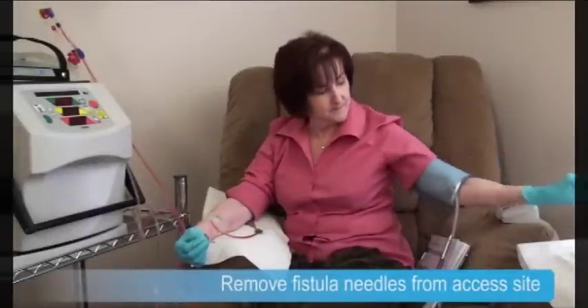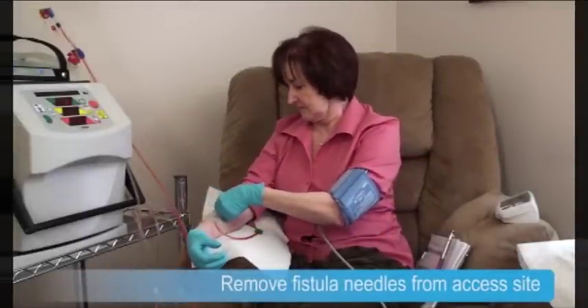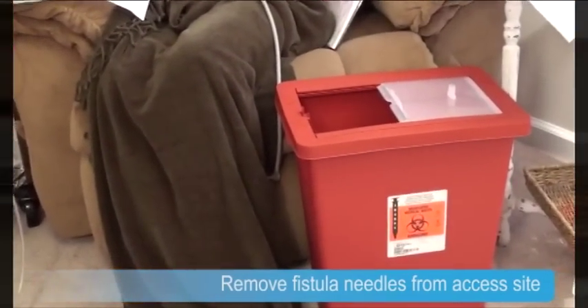She removes the fistula needles from her access site one at a time and cares for her access site. She also needs to make sure any sharps, like needles, are properly disposed of following her dialysis center's guidelines.